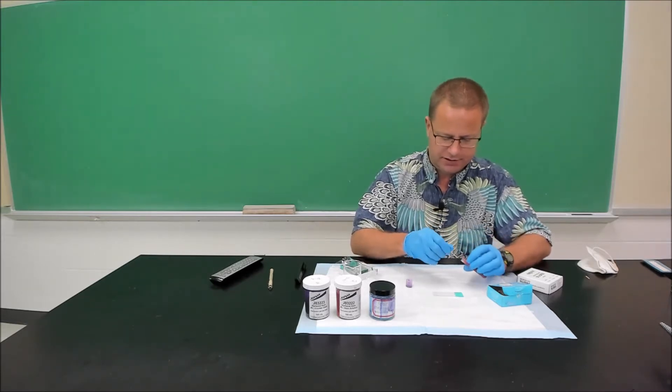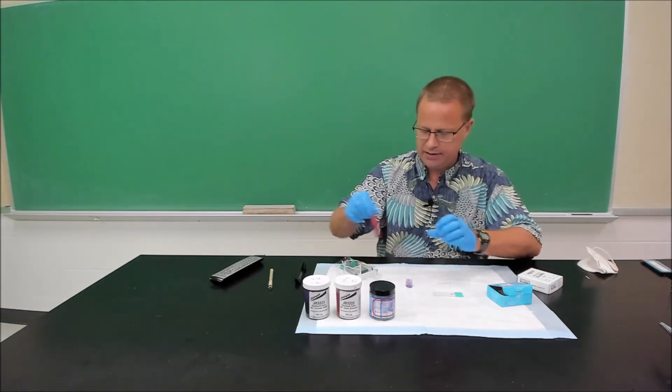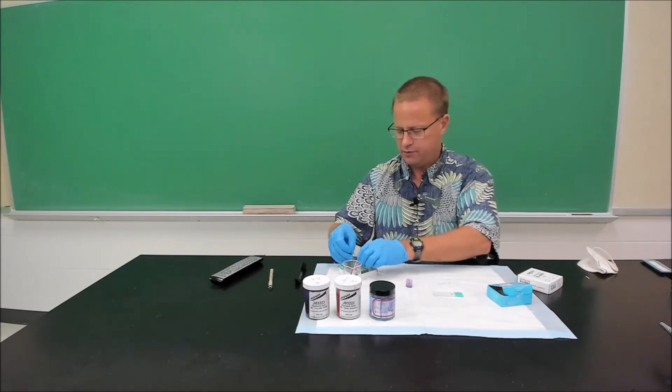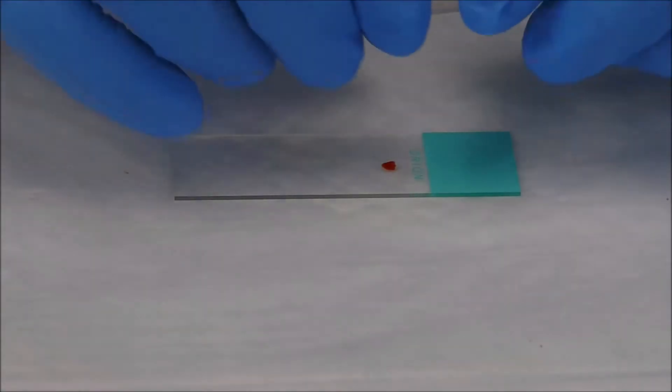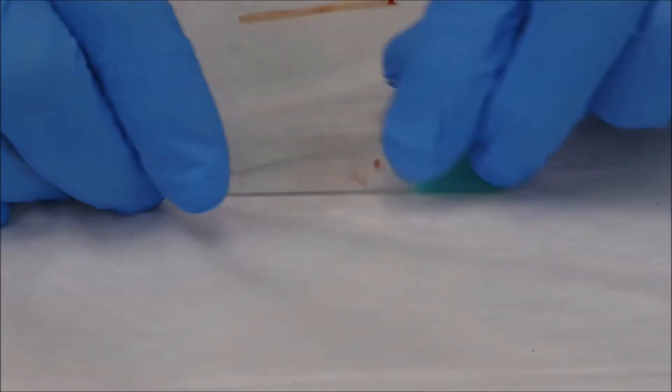And then we're going to put a big drop, not so big drop, on our slide. Then very quickly, we put our blood away. And then what we're going to do with the second slide, a spreader slide, is we're going to pull back over the sample until the blood runs up and down and then push very quickly that way. And that didn't work very well.